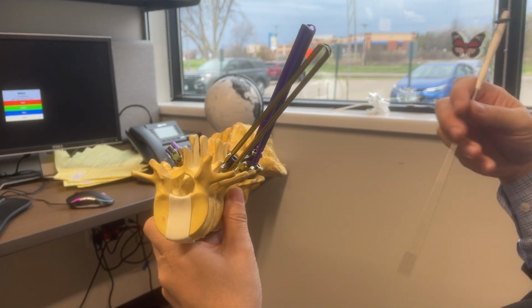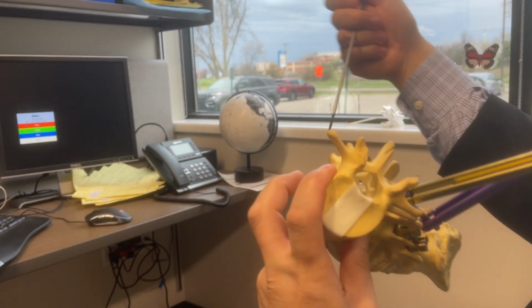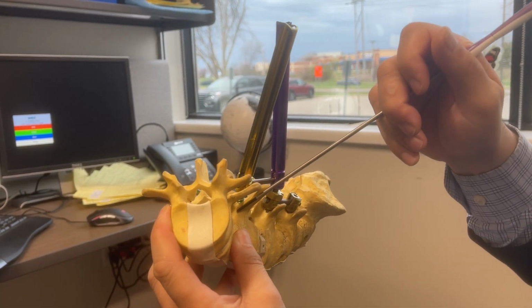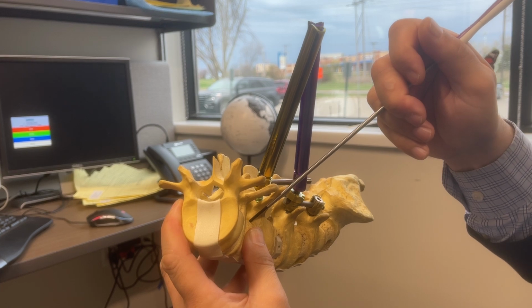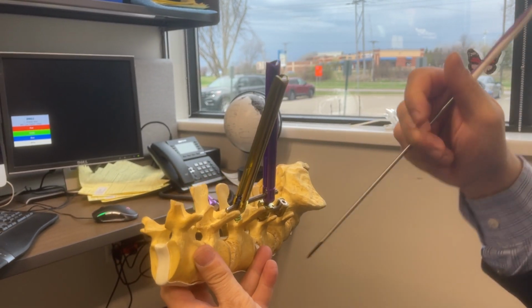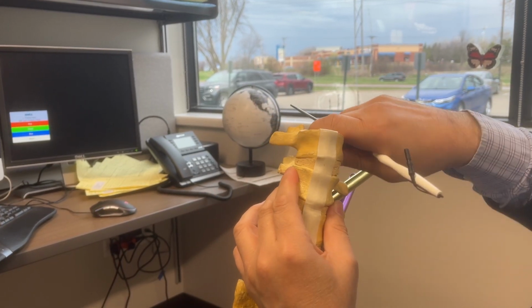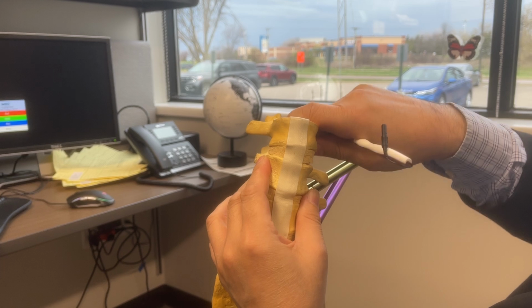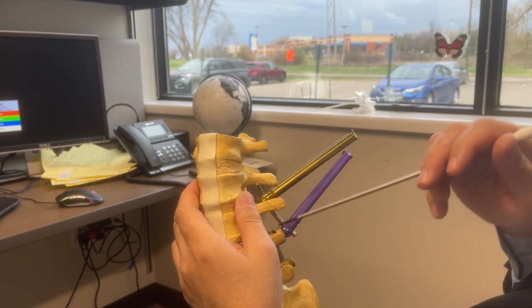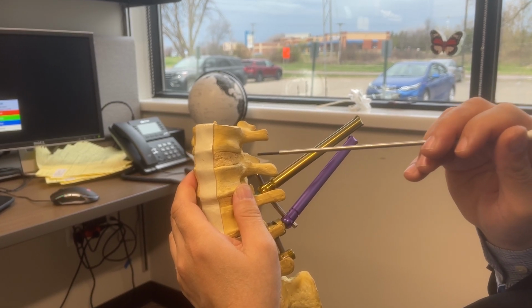Scoliosis: when there's a big scoliosis, I used to go from the side that's open, but now with experience, even in the most collapsed, I can still get in from the left side, and then I can decide to put the cage here, or put the cage all the way to the other side. By putting the cage from side to side, I can correct for so-called coronal deformity.